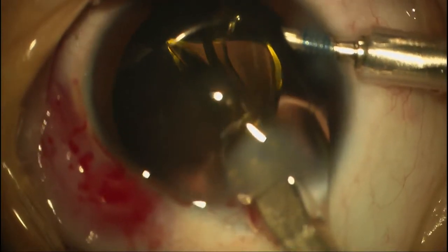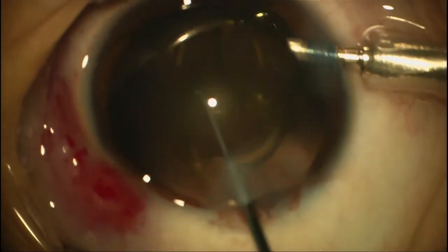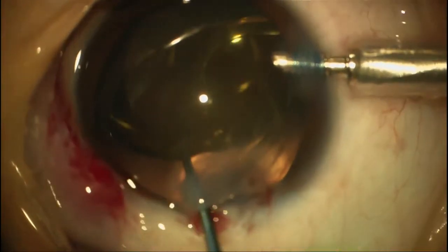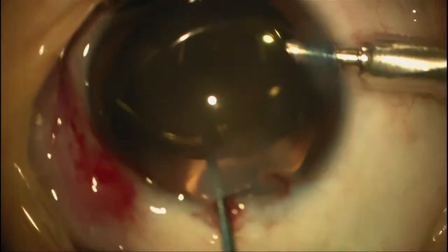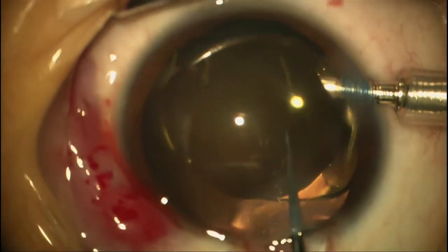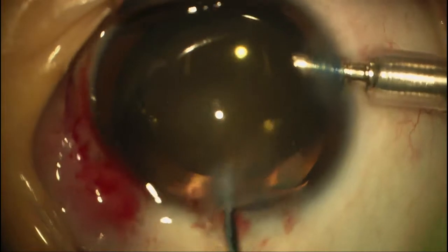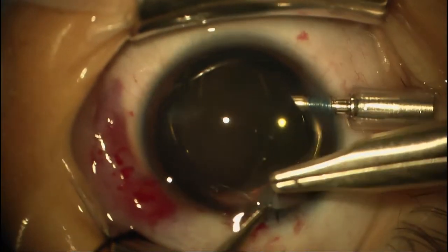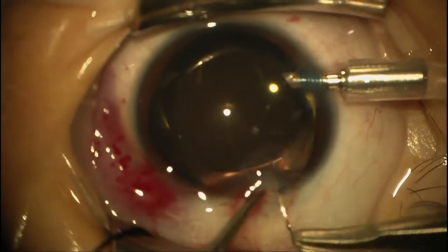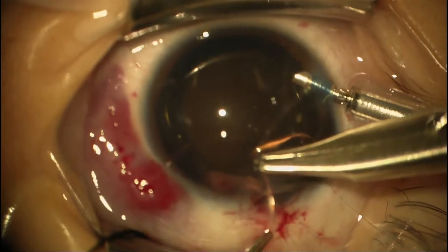Someone is asking when do you prefer to perform the YAG capsulotomy? I think the answer is probably the same no matter how old they are when they need it. Usually in a child it's similar to an adult, although you might have a higher threshold for the visual acuity drop-off. Usually when the vision drops to 20/40 or 20/50 you'll do the YAG. In a child like this it's a little different because this child is going to have amblyopia — you're not talking about someone who has 20/20 visual acuity. So you'll have to be guided by your ability to perform refraction and how blurry the view is on your clinical exam.